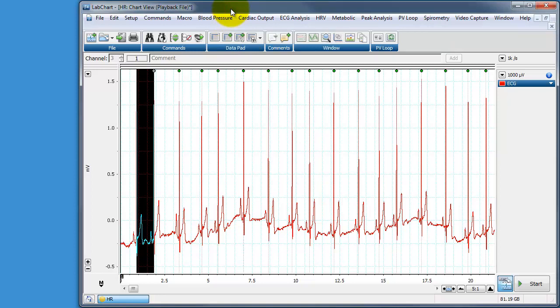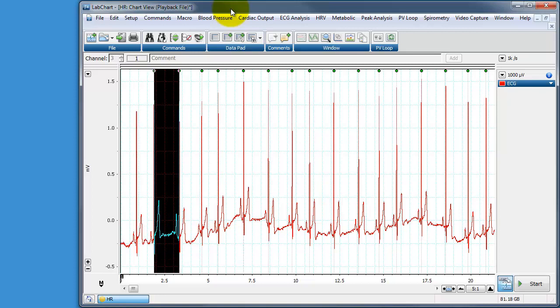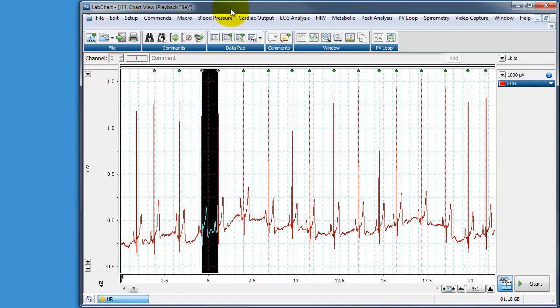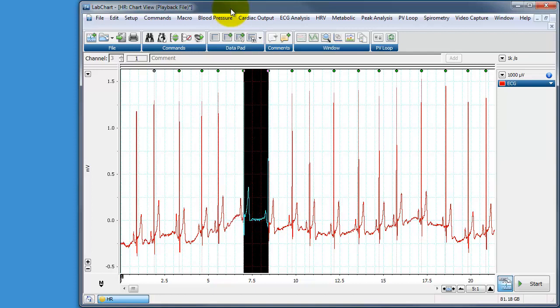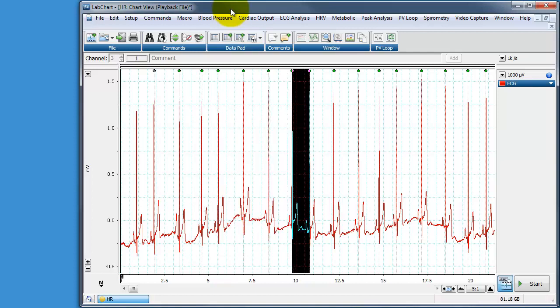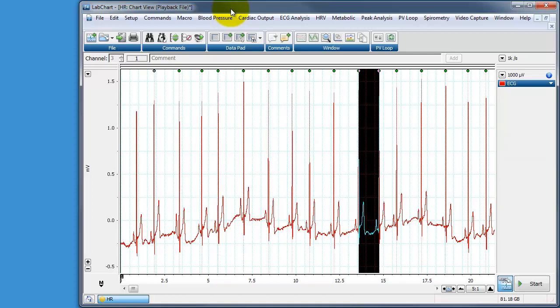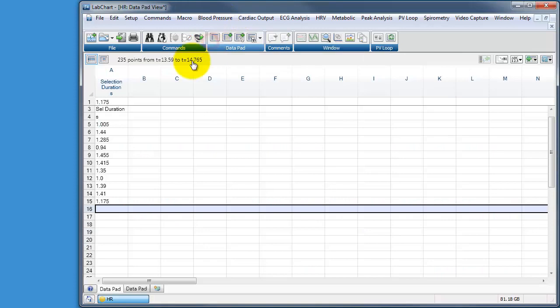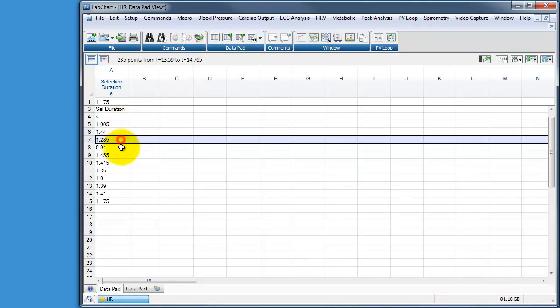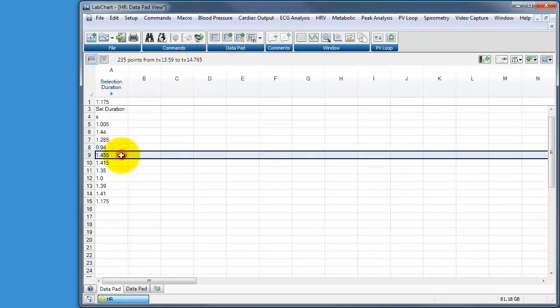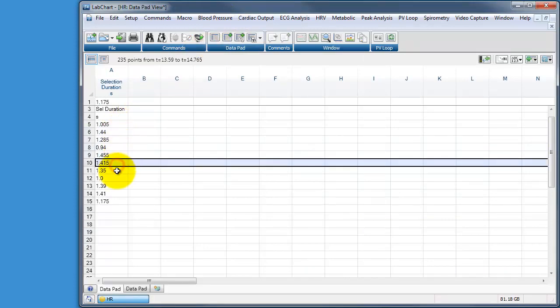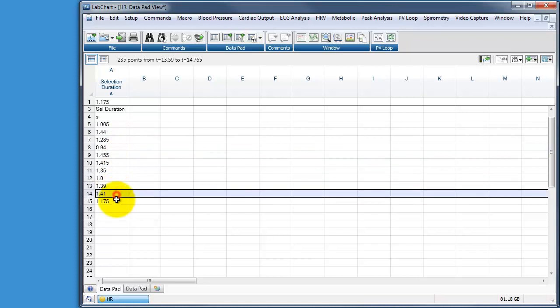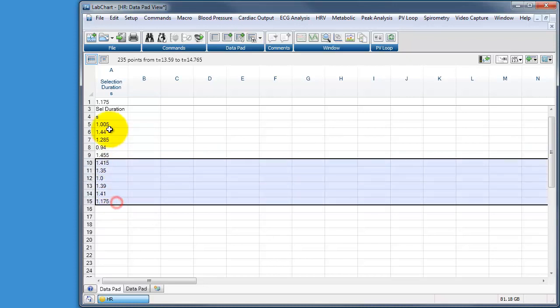That has added that to the data pad. I can then go to the next find, pressing control F3, add that to data pad, control F3, add to data pad using control D. And I can continue doing that for the first 15 seconds of data. Go to my data pad and you can see it's automatically now added R intervals into the data pad, which is great.